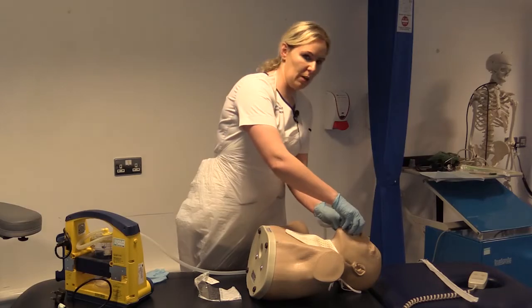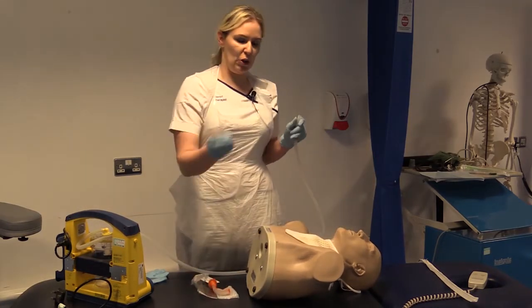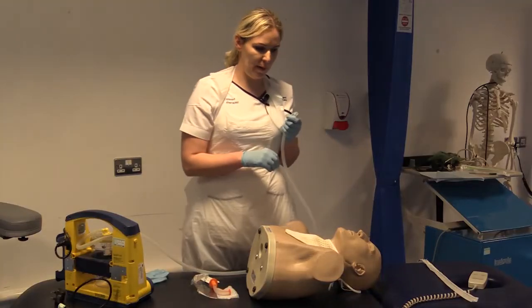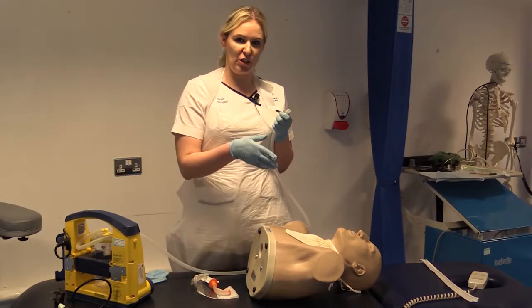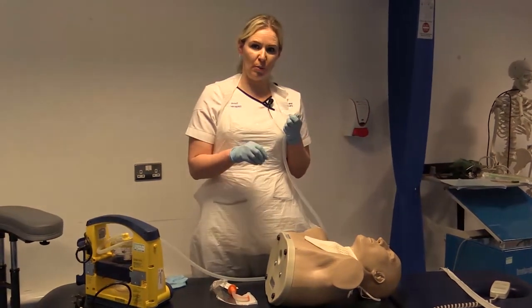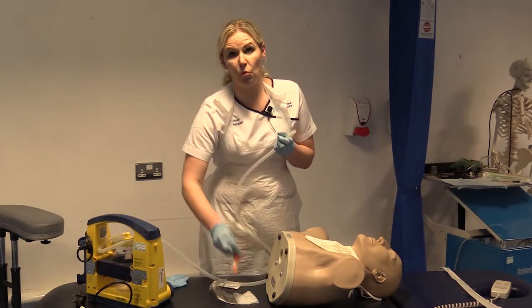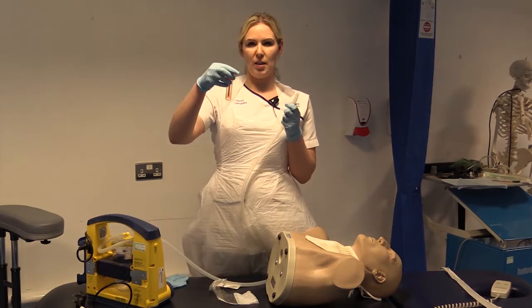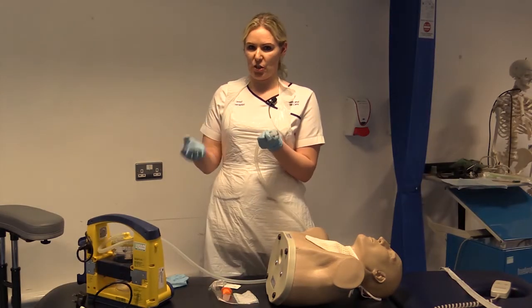You're going to remove your airway. You're going to reattach your oxygen, and then reassess your patient and decide whether you need to repeat your suction again. If not, you're going to check their clinical obs are returning to normal. You're going to flush out your suction tubing. You're going to wash out your airway with cold water so that you can use it again. And you're going to remove your PPE and wash your hands.